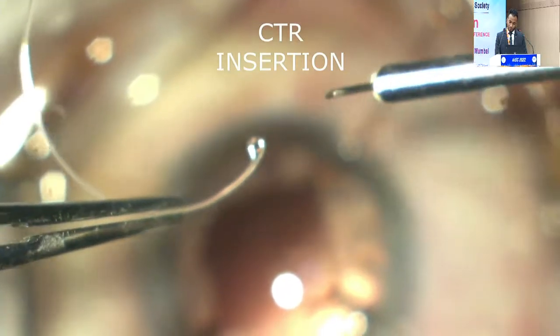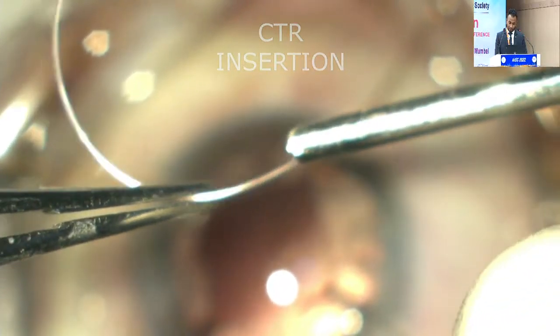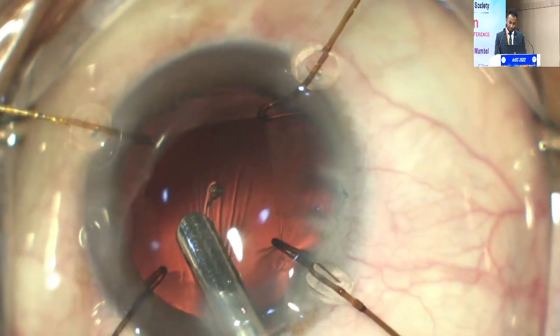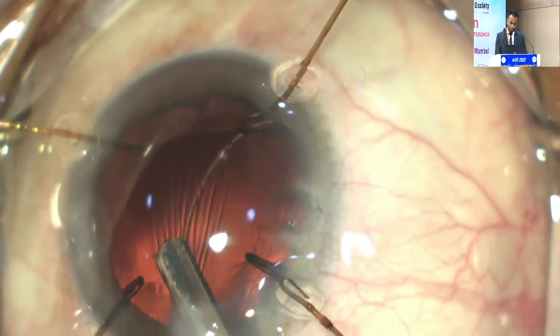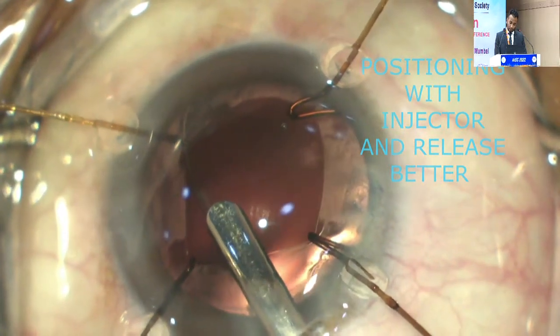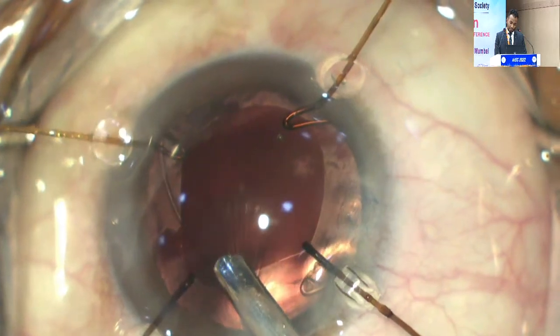I preferred to do it with the injector because you can place the eyelets on the opposite side just by going from the same wound. Otherwise, you need to put it through another side port. See, it will come in the opposite and it will stabilize the bag now.